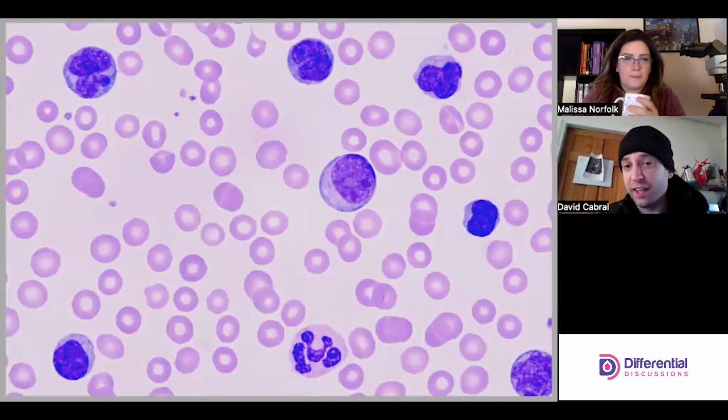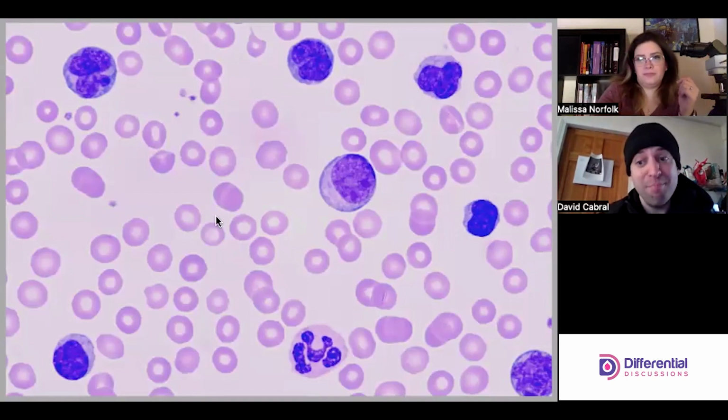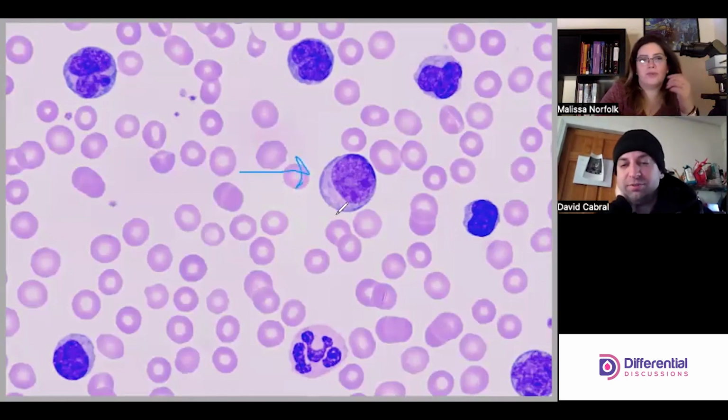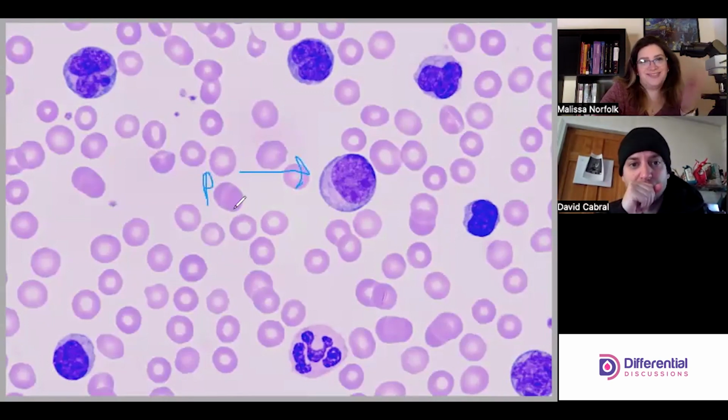But on the other side of things, the center field looks like a prolymphy kind of cell that may have exploded if not for the albumin preparation. This is a beautiful example, yeah, exactly. That's the prolymph we're talking about here. And outside of the neutrophil, everything else is just a regular lymph. Even this.